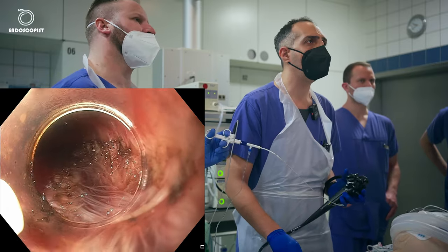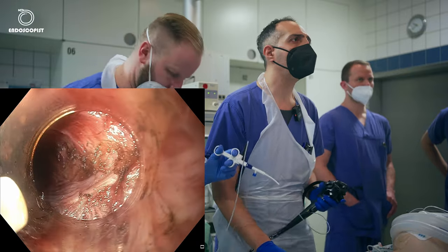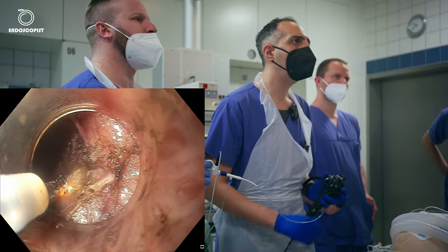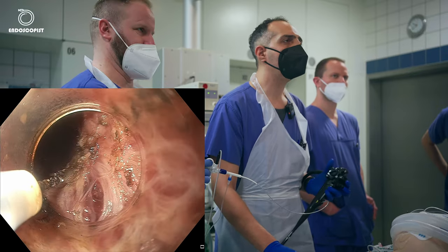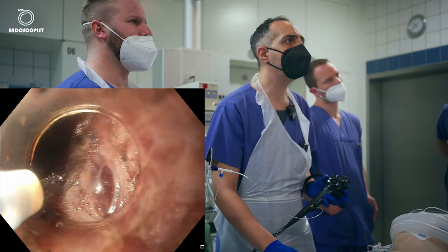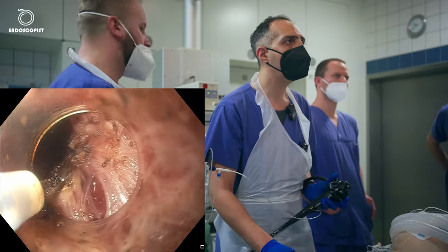I will just withdraw a little bit backwards and have a look. I will cut this here. As you can see here, the longitudinal fibers are very thin. You can see here the adventitia through the muscle fibers. Sometimes the mediastinum will be open, it's fine also.